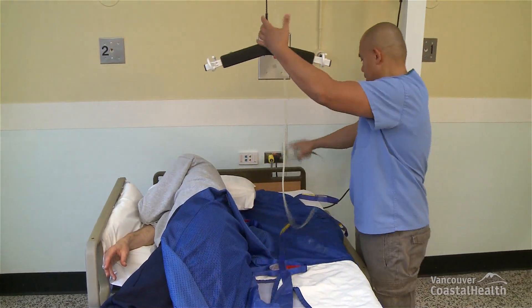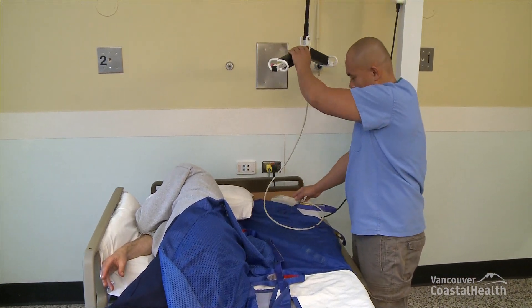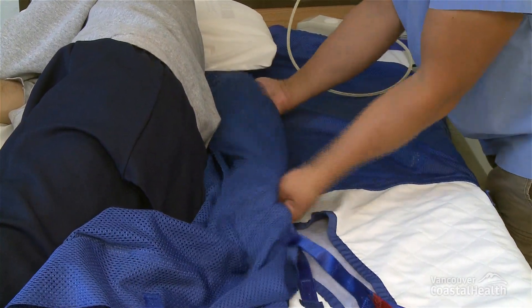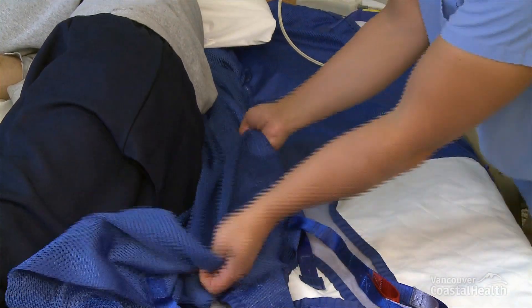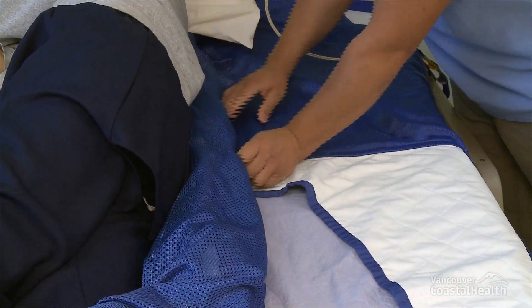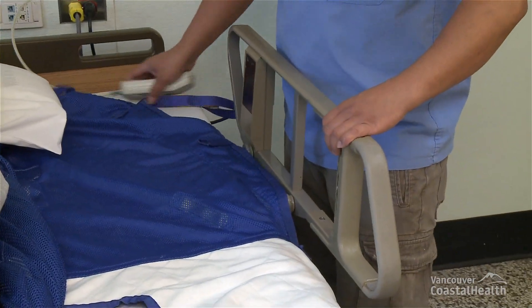Lower the carry bar and disconnect the positioning sling strap. Ensuring that the sling straps are covered by the sling fabric to prevent rubbing against the resident's skin, roll the positioning sling as far under the resident as you can safely do. Raise the bed rail on the side where the sling has been disconnected and rolled under the resident.